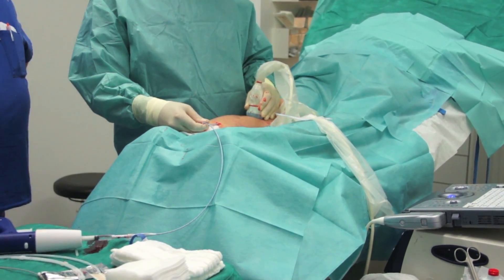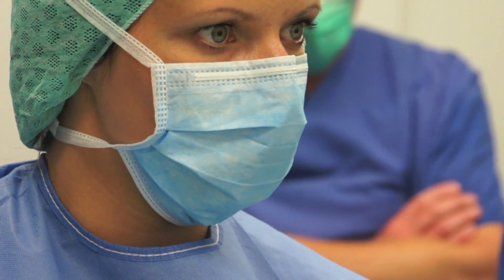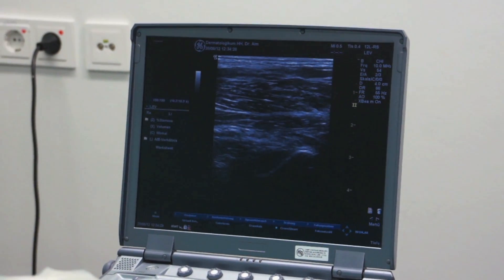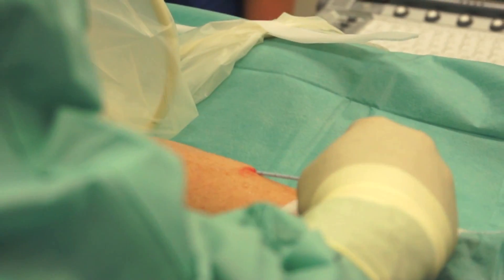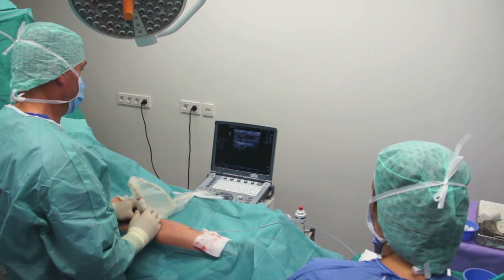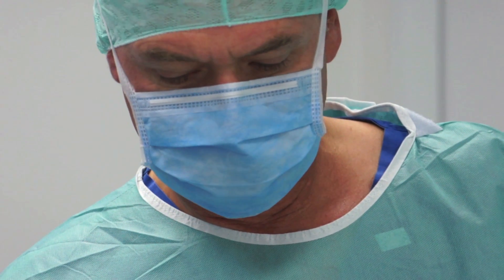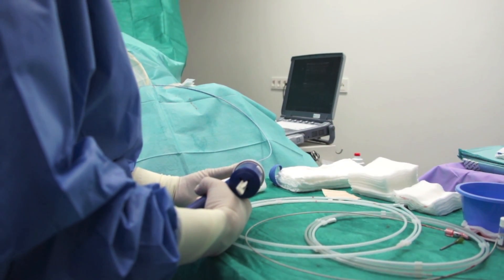Using ultrasound the catheter is positioned very precisely, and you can see that the staff are watching the ultrasound machine at all levels to ensure that the catheter placement is very precise. After the superglue is delivered the catheter is withdrawn and pressure is applied to the vein to get it to bond instantly.